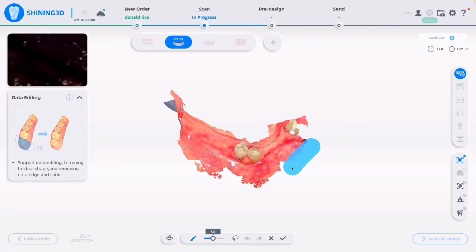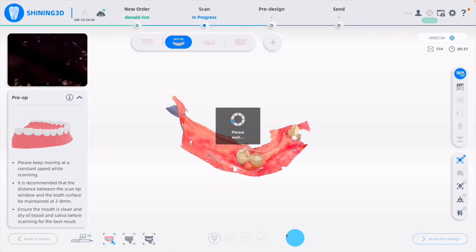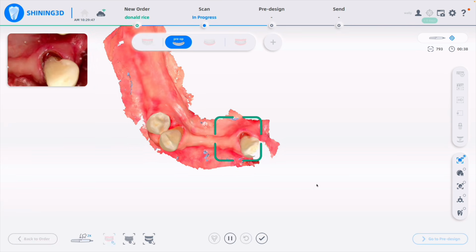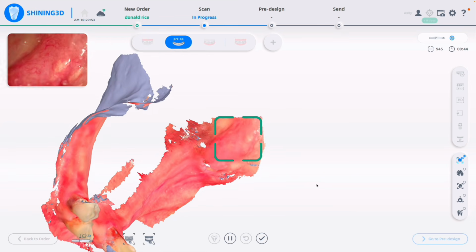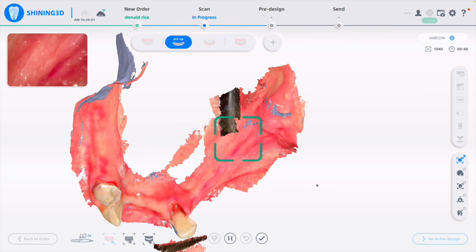So as you'll see here, I'm scanning the preoperative condition with, in this case, the ELF, and I'm anticipating the need for a distal extension removable partial denture. But I'm going to remove that anterior space and turn that Kennedy class 4 mod 2 into a Kennedy class 1 situation with bilateral distal extensions, but with an anterior bridge there, because his cuspids are strong.